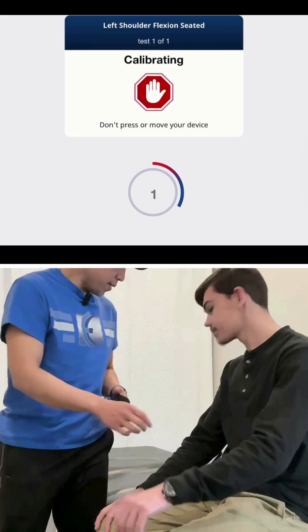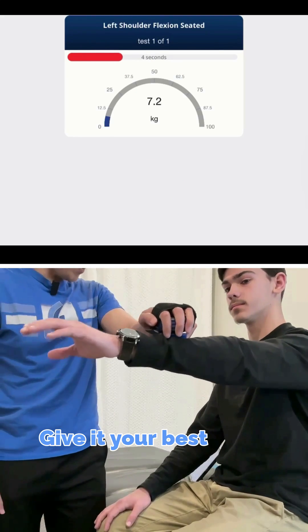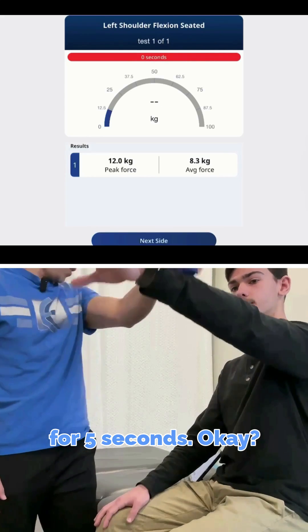First, it calibrates — you don't push any pressure. Go ahead and push up. Give it your best effort for five seconds, and you can stop.